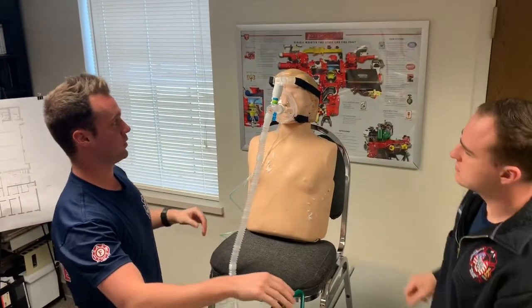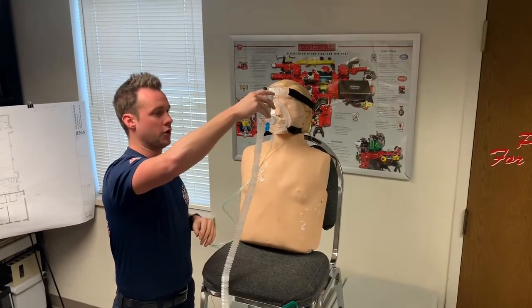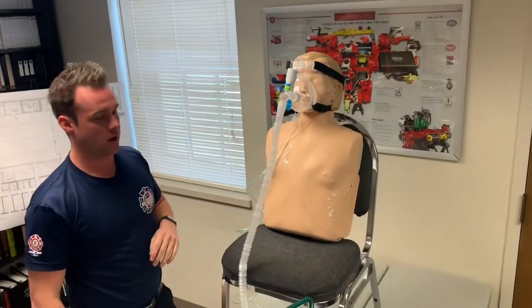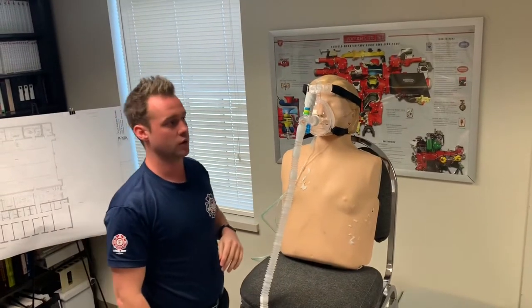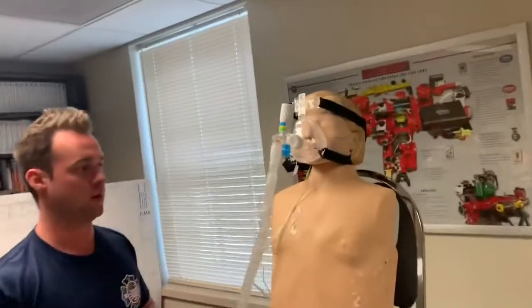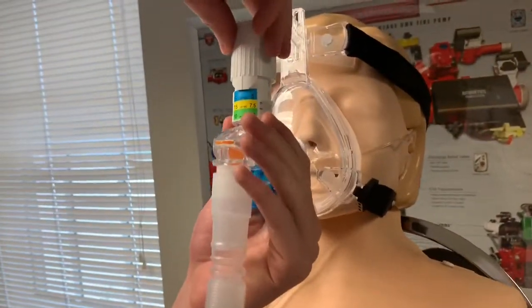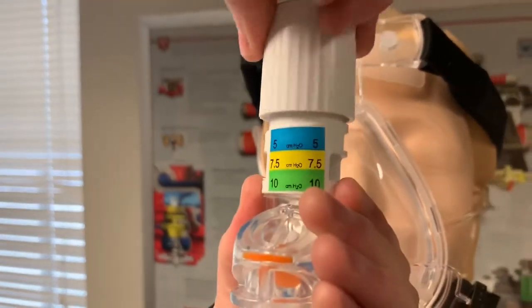And now that we have a seal, we can set the PEEP. So protocols dictate that for COPD emergency, you want to start at a PEEP of about 3 to 5. And for pulmonary edema, you want to start at a PEEP of 10. You set it by just turning this dial.